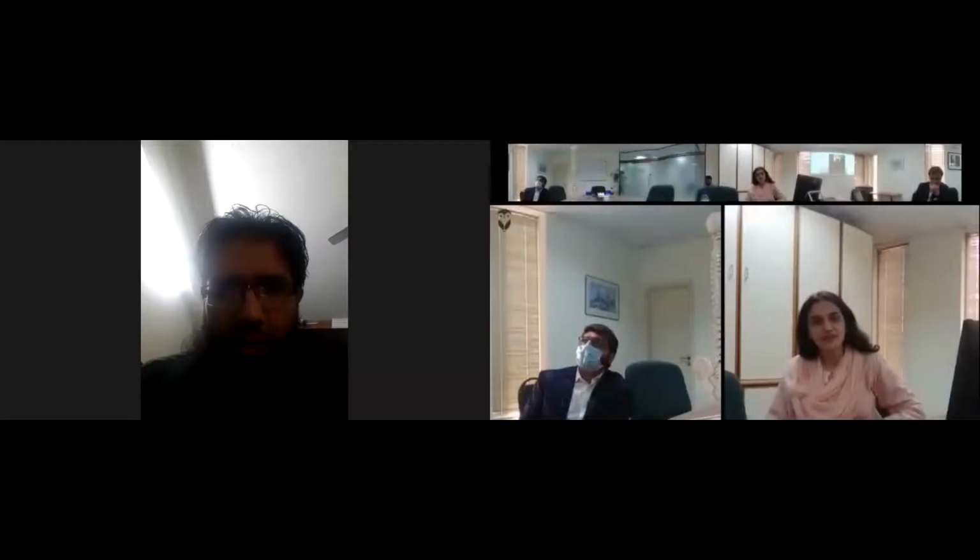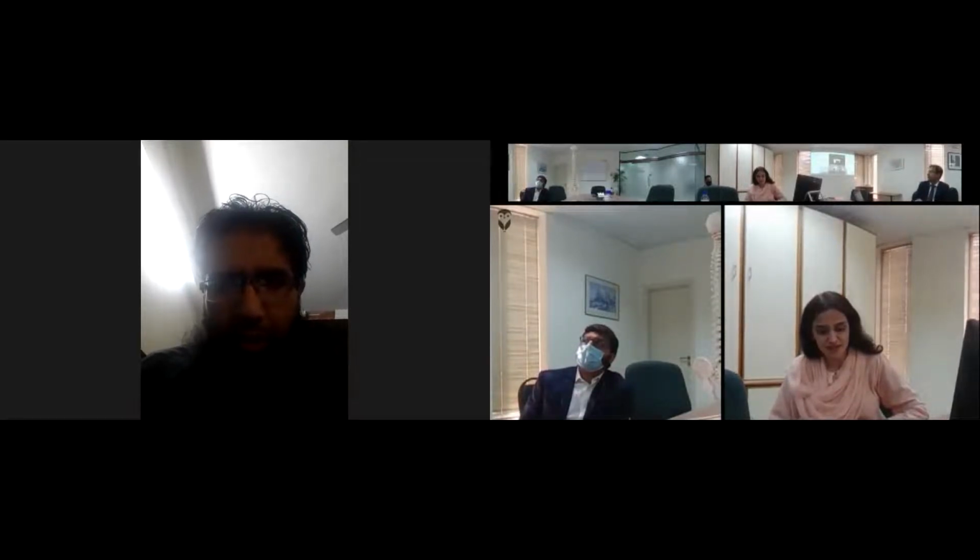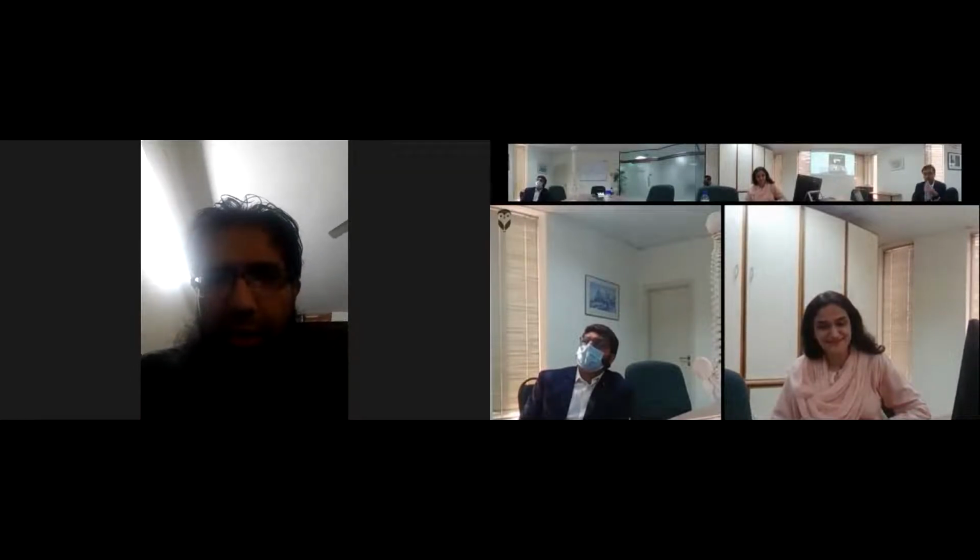It's regarding the DSA. What is DSA? A little bit like, elaborating on it. And is it good to have, or is it essential to have for the pain procedures? How would it help us as pain physicians? I think this would be related to somebody who's doing the intervention or digital subtraction angiography. I think this would relate to those who are doing fluoro, I believe.